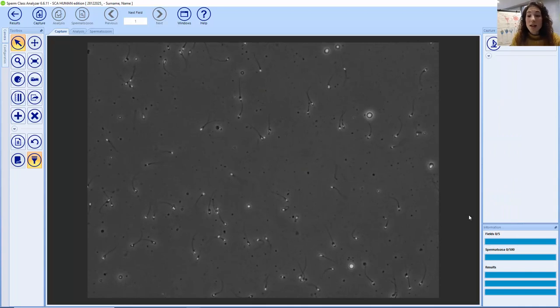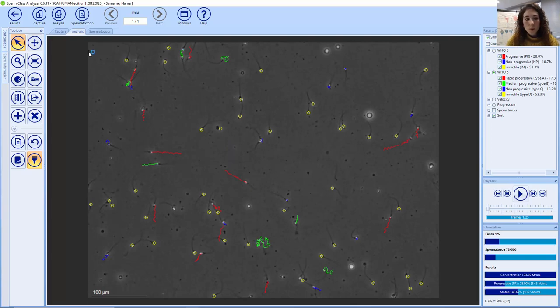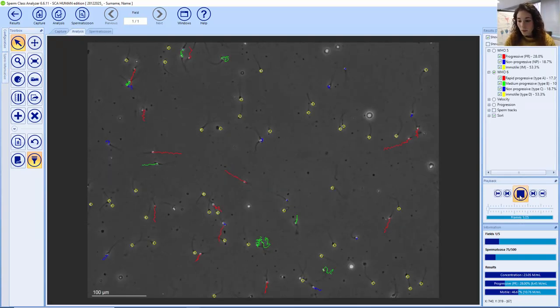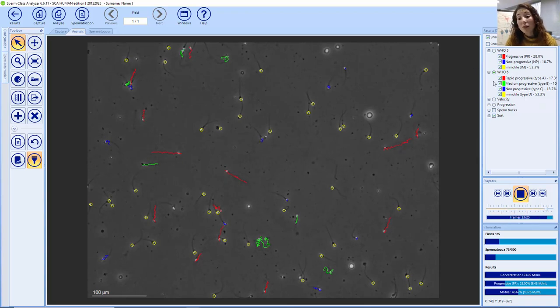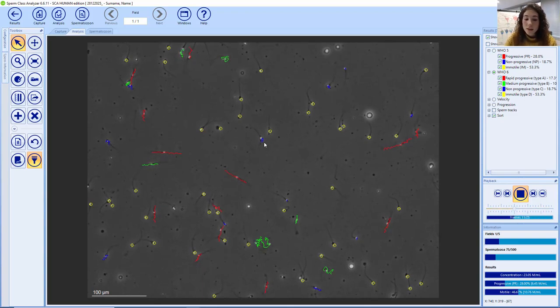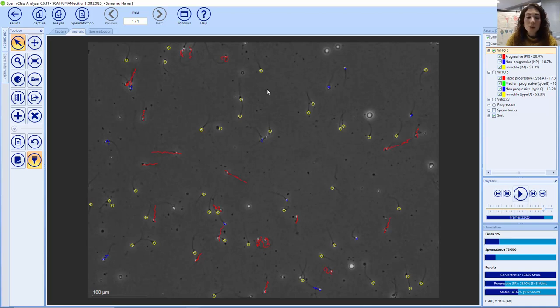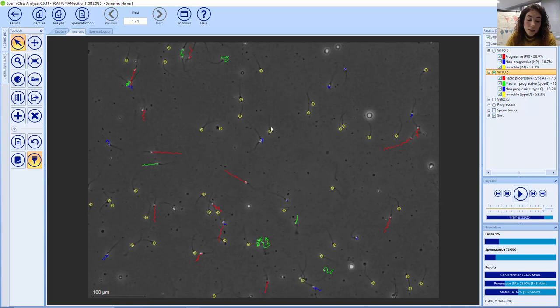For example, this is the SCA Evolution. Here we have a video of a sample in a counting chamber. After analyzing this field, you can see that on the right part of the screen you can select whether to follow the 6th edition classification containing the four types of sperms — yellow ones are immotile, blue ones are type C, and so on — or if you prefer the WHO 5th edition, in which type A and B are altogether considered as progressive.